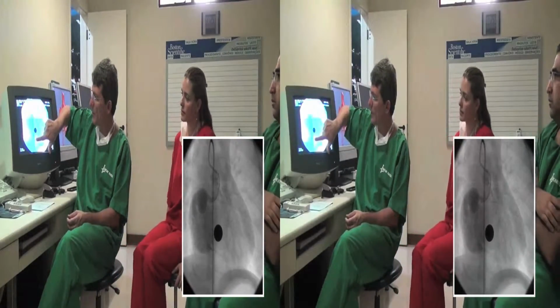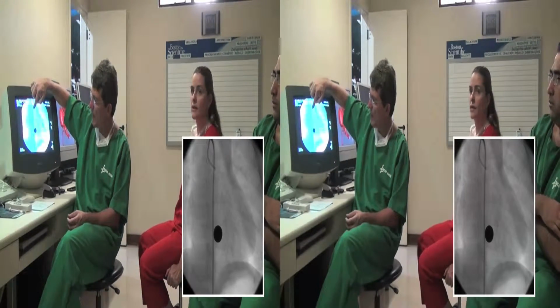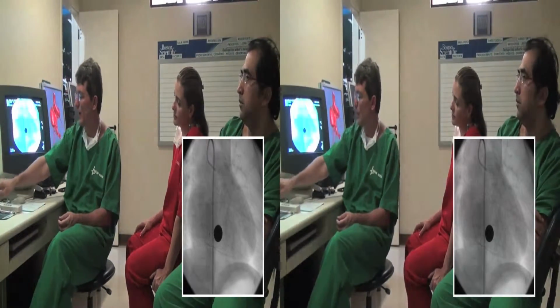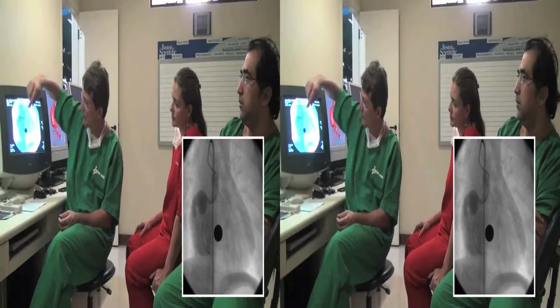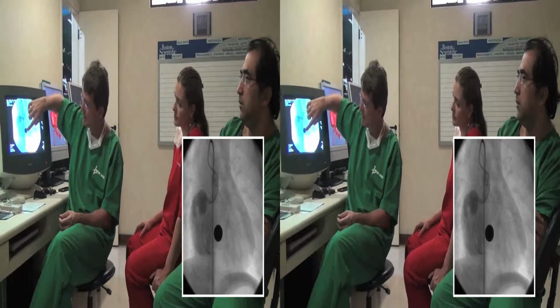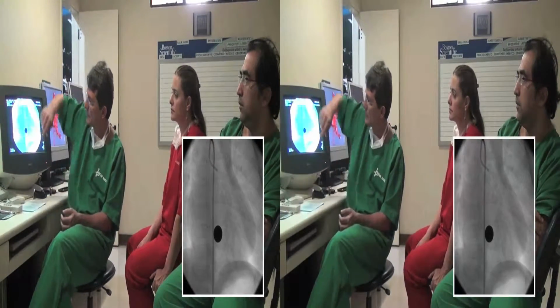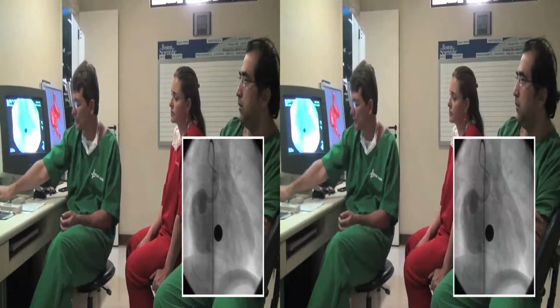On this screen we are presenting the case. With the catheter we introduced through the ascending aorta, we can observe the fistula from the ascending aorta, very dilated, forming an aneurysm, emptying into the right atrium. This fistula originates above the right coronary, seen in this image, as observed dynamically. Through the catheter, we injected the contrast, filling the fistula and the right atrium.